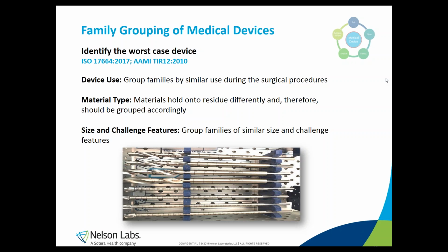And if you look at similar surgical procedures, the expected debris that will stay behind on the devices will be very similar. Furthermore, if material types are identical, they tend to hold debris in a similar way. Different material types are also known to hold on to residues differently. And finally, based on the design of the device itself, a worst-case device for a family group can be identified, which we will then use during our validation of a processing procedure and will then represent the entire family.